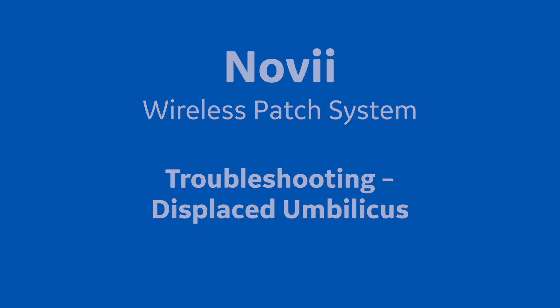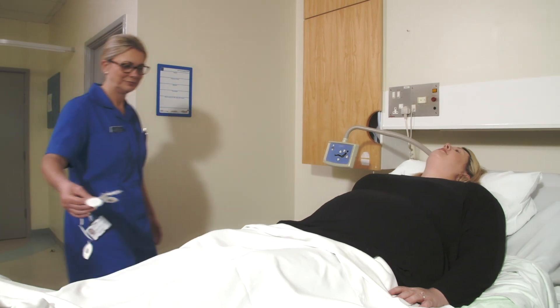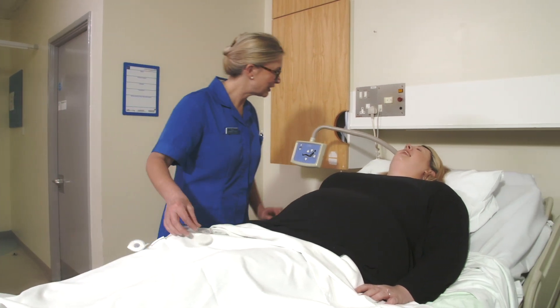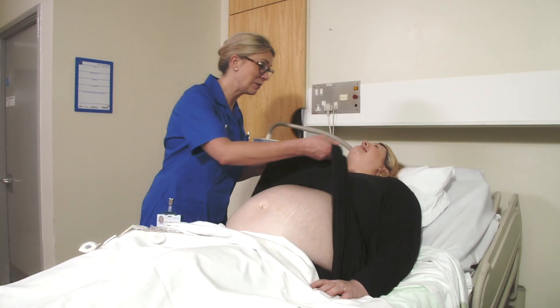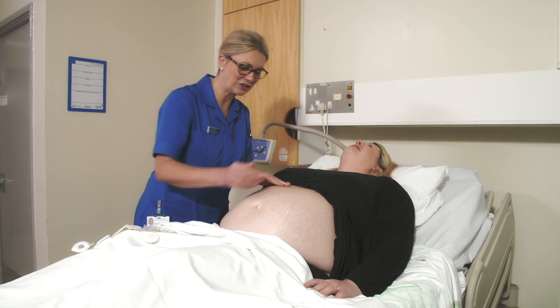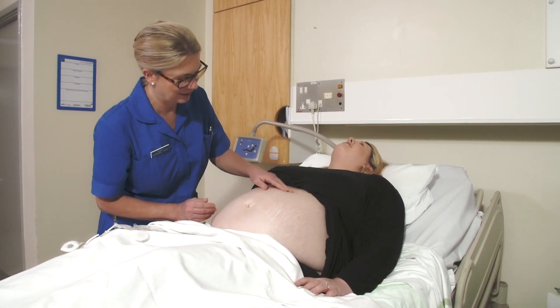When you have a large mom to monitor, the umbilicus can be displaced and may no longer be a good reference point to use when placing the patch clip. The objective is to place the patch clip over the center of the uterus, midway between the fundus and the symphysis pubis. But estimating where the center of the uterus in a large mom is can be difficult.